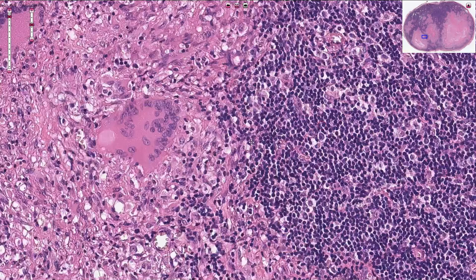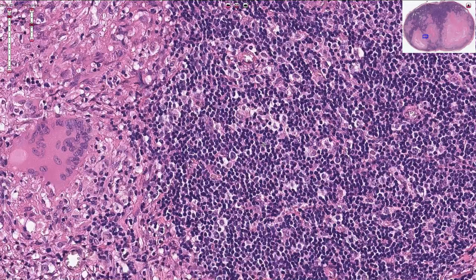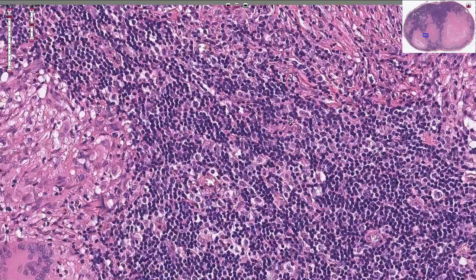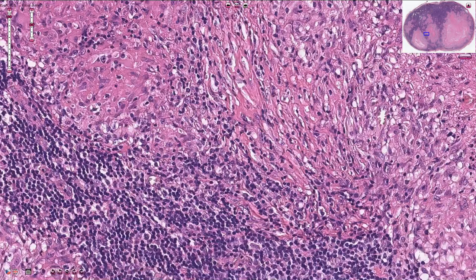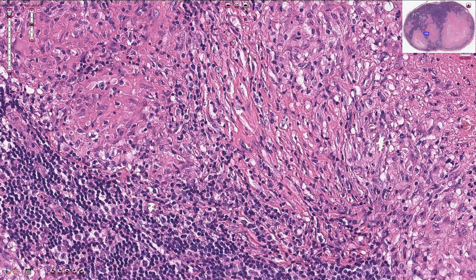Around the epithelioid cells we have a rim of lymphocytes, typically T cells, and further out we can see fibroblasts which produce collagen fibers. These fibroblasts try to wall off the process and contain mycobacteria inside the granulomas. The thin pink strands are collagen fibers, and the spindle-shaped cells with elongated nuclei are fibroblasts.